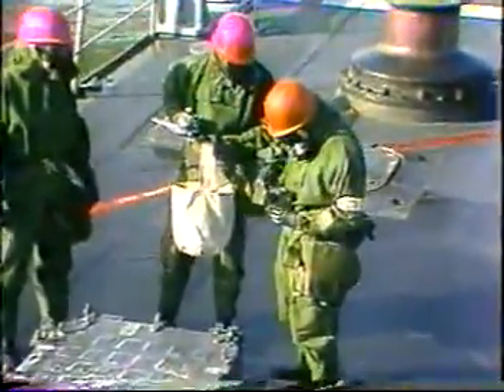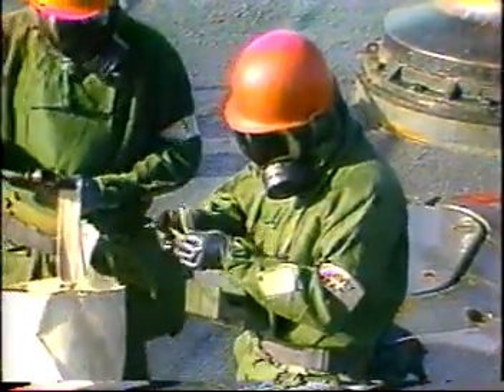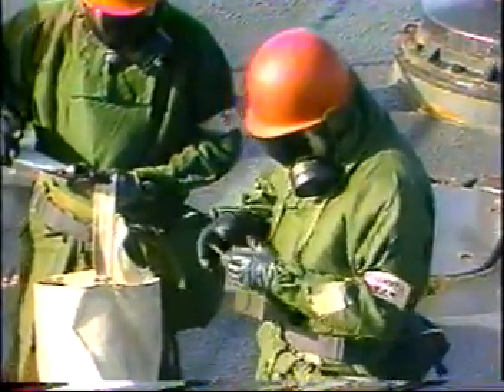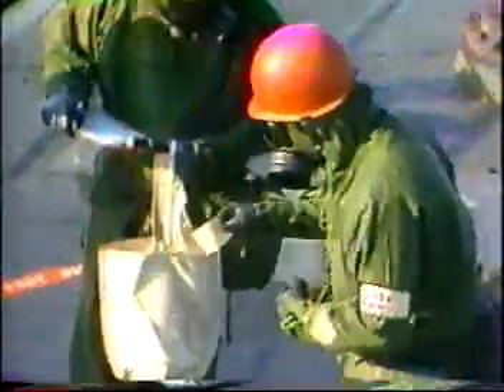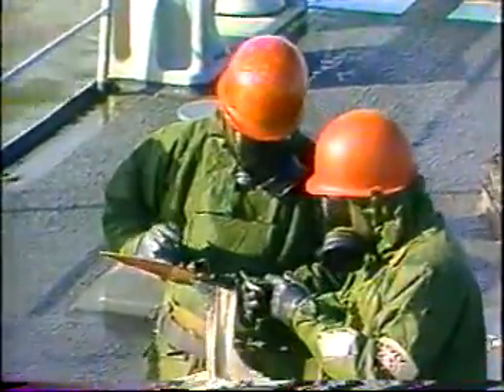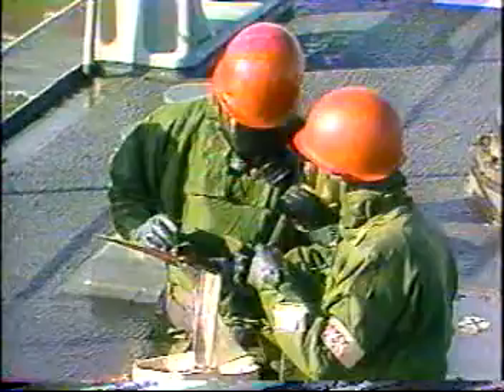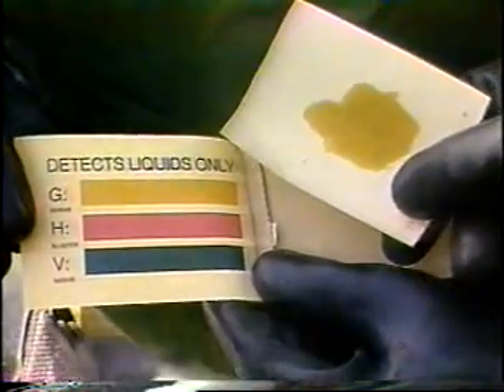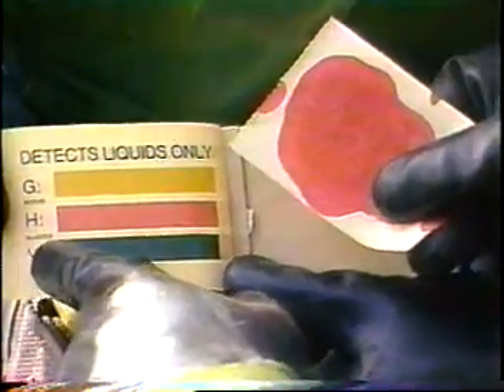Outside, another monitoring and survey team will check for liquid contamination. To test for liquid chemical agents, a fresh sheet of M8 detector paper is used for each surface to be checked for contamination. Blot the surface with the paper and wait approximately 20 seconds for the results. When the time is up, check the paper for any color change. A dark green color indicates a liquid V series nerve agent; yellow to yellow-brown indicates a liquid G series nerve agent; and red or scarlet indicates a liquid blister agent.